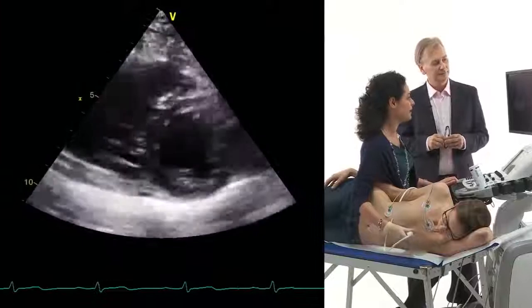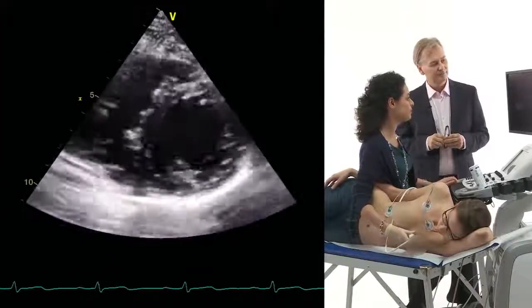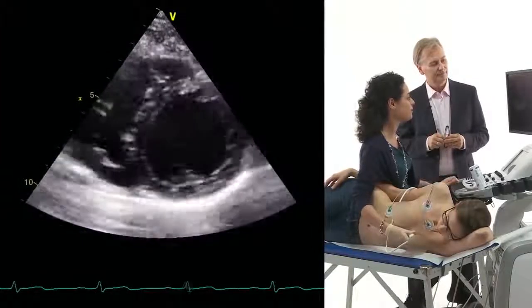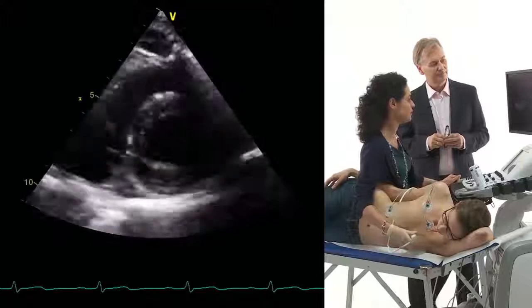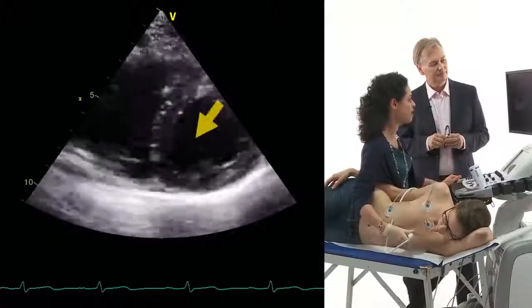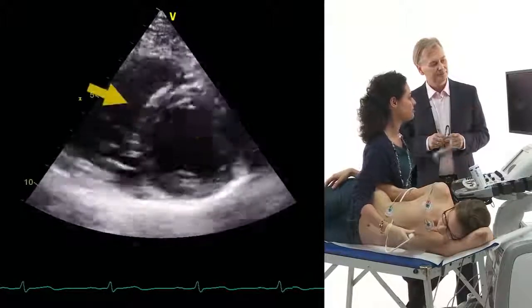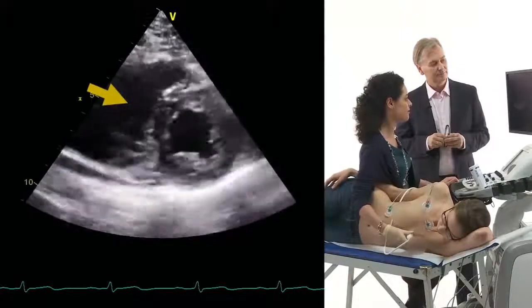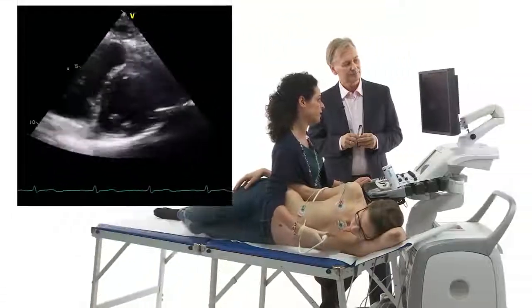This is a parasternal approach in the short axis view. So we really see the ventricle in its round shape. And the other structure is the right ventricle, which has a crescent shape.